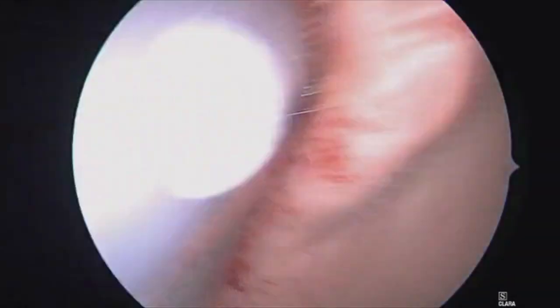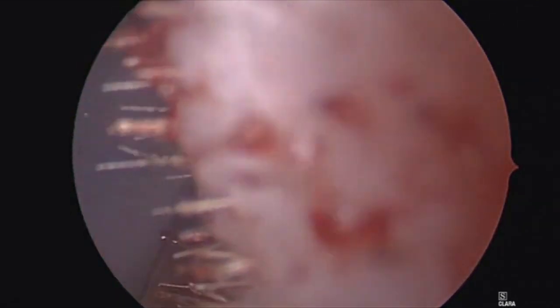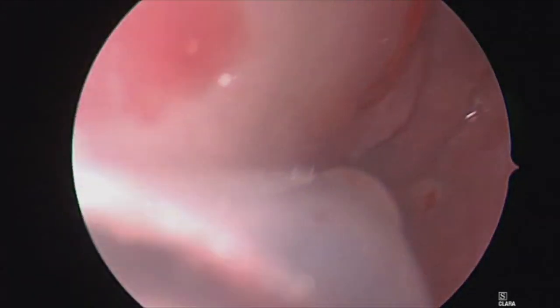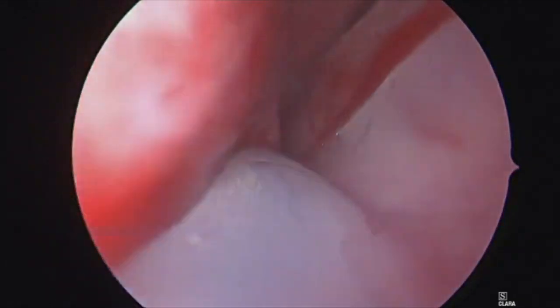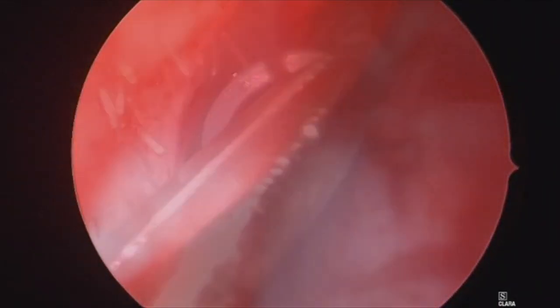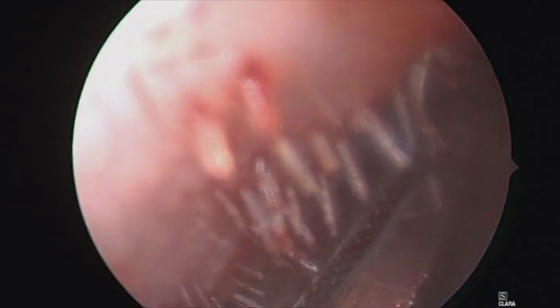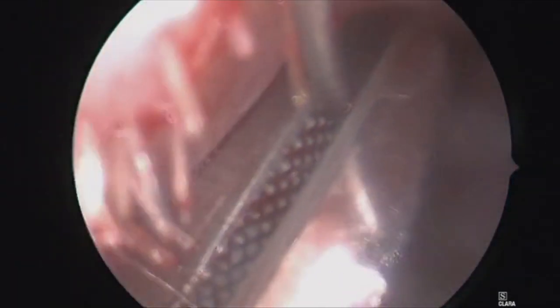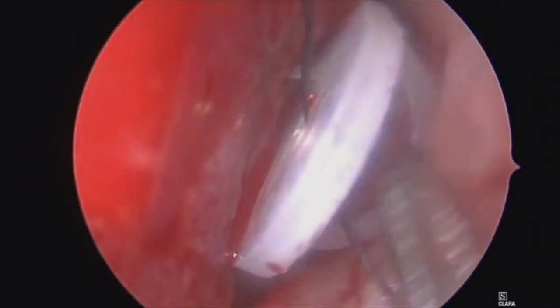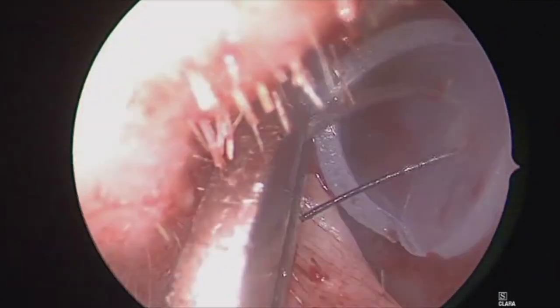Doyle splints are optional — I don't use them in all cases, but in select cases I think they're helpful to hold things in place in the middle and allow adequate space while the patient heals. Here we are inserting the left-sided splint nice and low along the floor of the nose, then putting in the right-sided splint and securing them anteriorly with a nylon stitch. I like to make sure that the front edge of the Doyle splint covers over the site of my incision. We pass the stitch through the hole of the Doyle splint on both sides and then pierce the splint itself a little further back to ensure that the suture does not cheese-wire through it and tear.